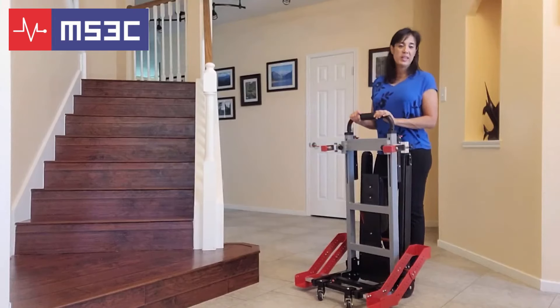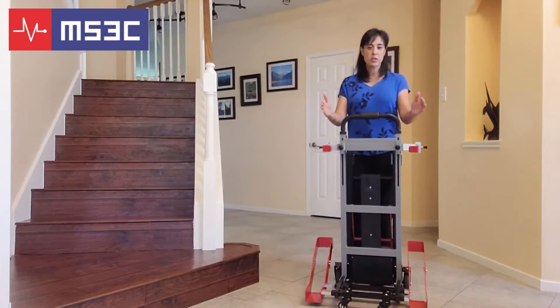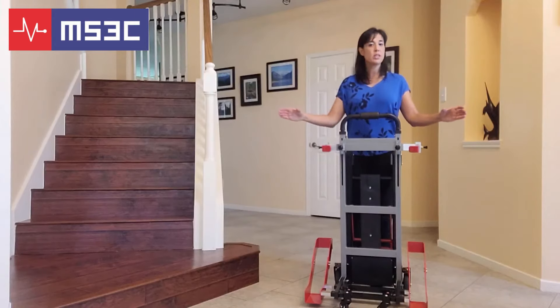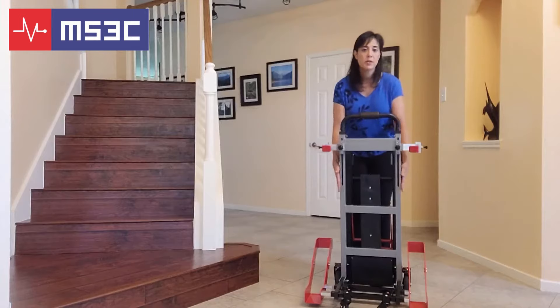This part of the video is a recap of the minimum and maximum dimensions needed for your specific wheelchair. The red wheel supports are adjustable. When they are in the full inward position, you have a clearance of 18 to 22 inches between the red channels. At their maximum position, you have a dimension clearance of 22 to 29 inches. For your wheelchair's minimum clearance, you are going to need at least 18 inches between the back wheels to accommodate the frame.